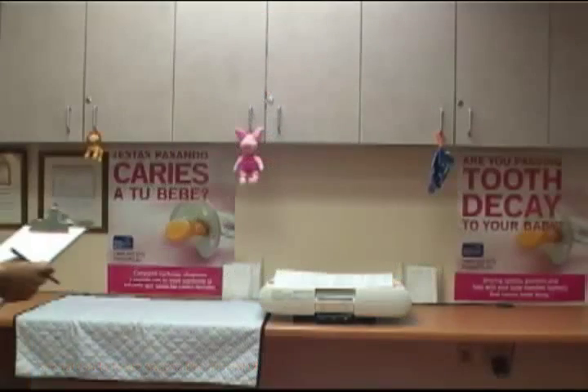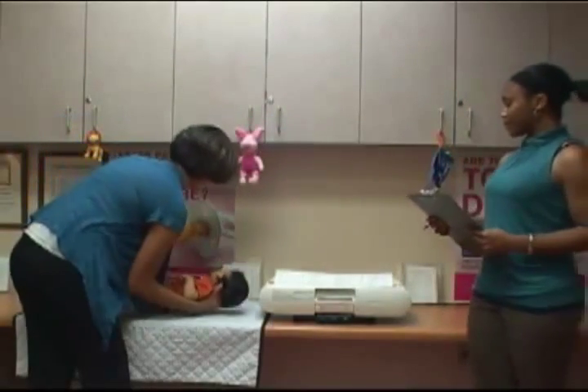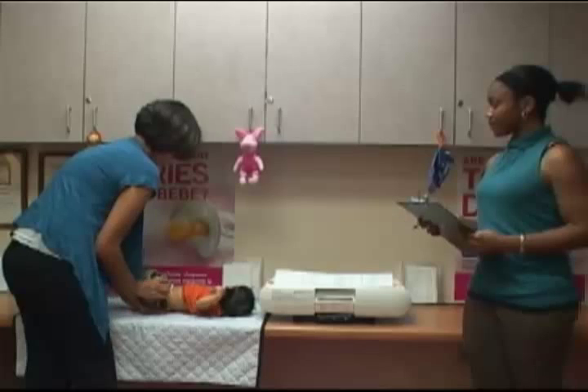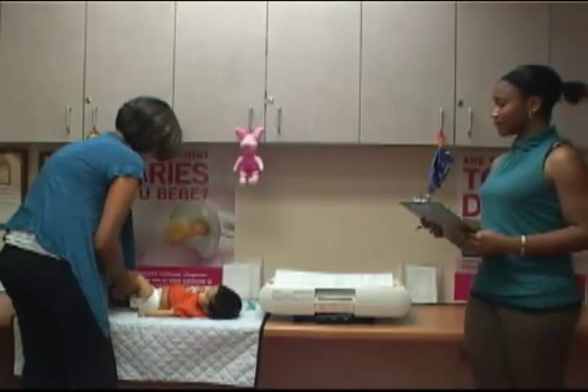In this video, we'll be taking the weight of a 2-month-old infant using an electronic scale. Before weighing, have the mother or caregiver take off the infant's clothes such as shoes, pants, jackets, sweaters, or hats that will affect the weight.